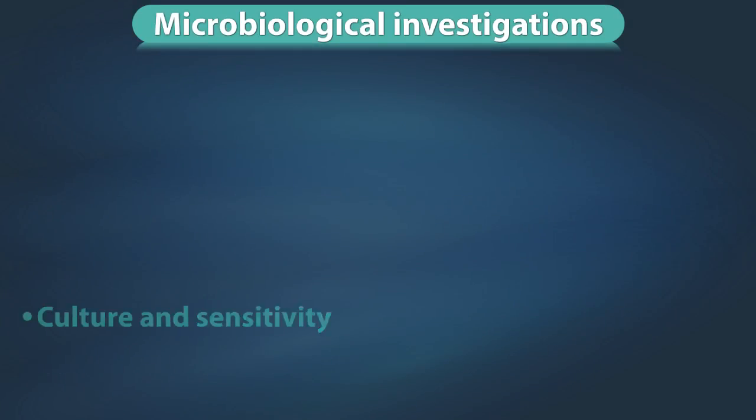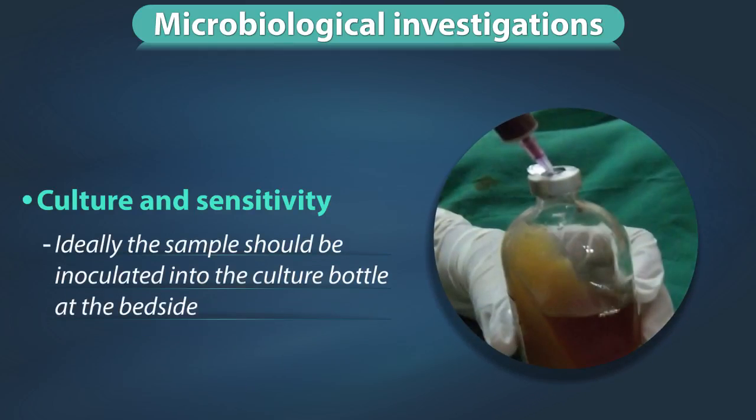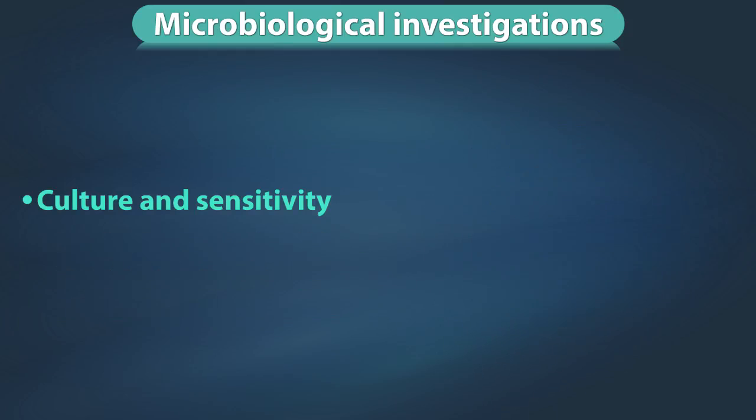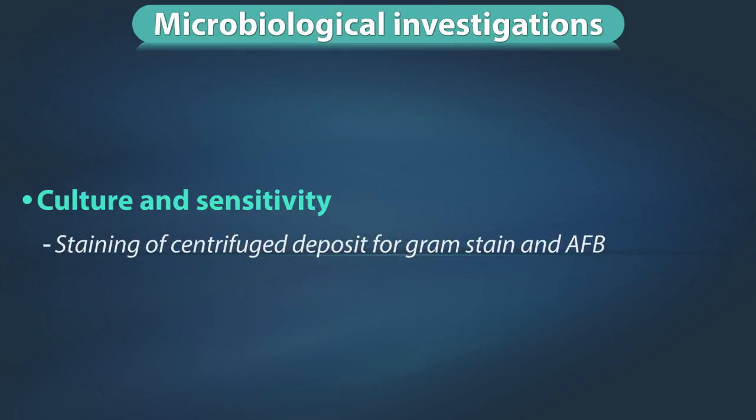Microbiological investigations. Culture and sensitivity. Ideally, the sample should be inoculated into the culture bottle at the bedside. If not possible, it should be processed in the microbiology department in the lab. Staining of centrifuge deposit for gram stain and acid-fast bacilli is then carried out.